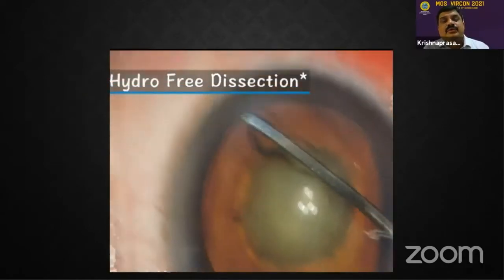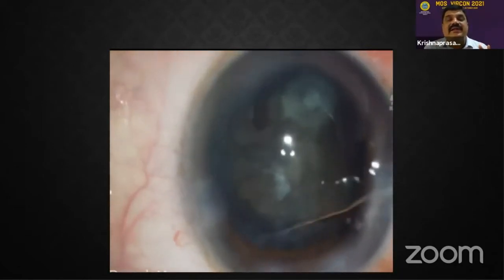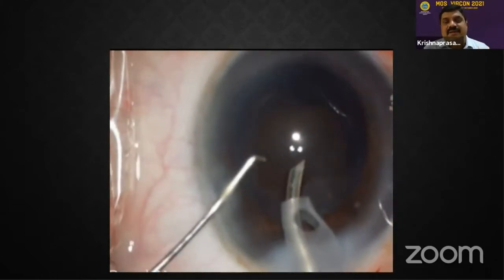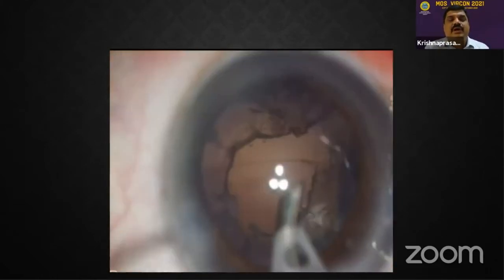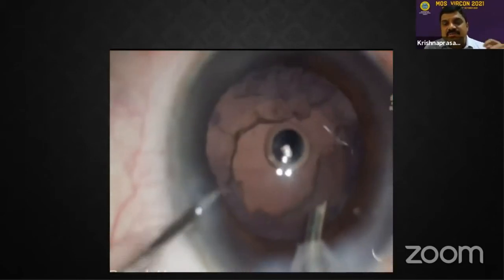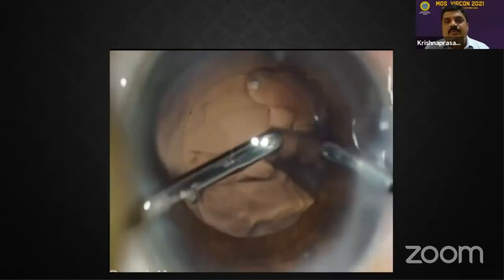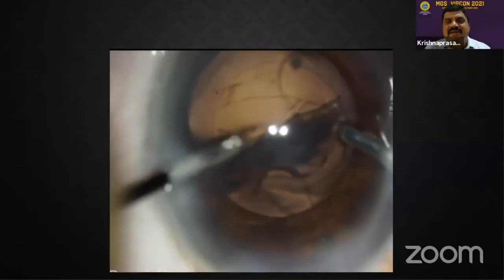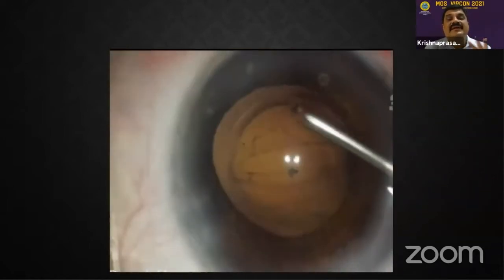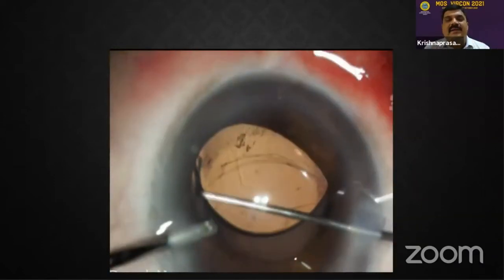See, this is a case I'm showing you with a patient with posterior polar cataract. You can see that there is already a rent noted. Already we know that in PPC the chances of a rent are always there. So when you notice the rent, always take out the dialer from the side port, push a dispersive viscoelastic, then remove the phaco probe, then bimanual irrigation definitely helps you to take out all this cortical matter. You can see that the rent is not extending. In such cases, you can put an IOL in the sulcus with optic capture.